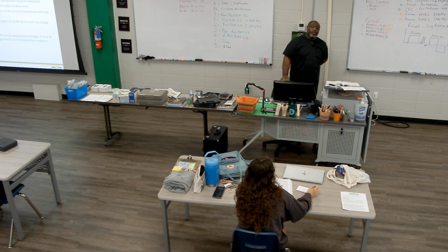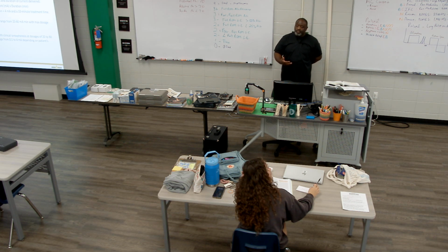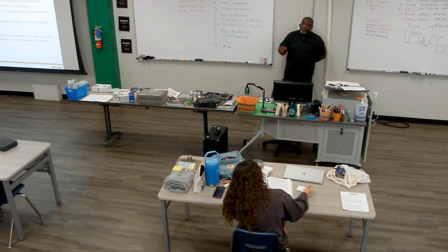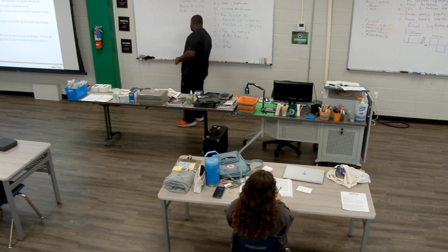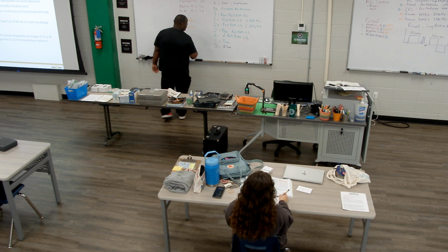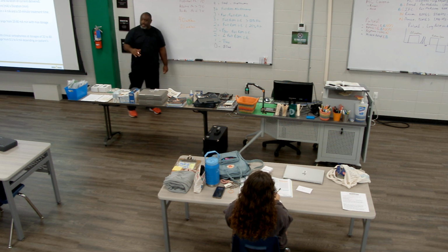That's not preset by the device; it's usually communicated to you by the physical therapist. They may say, I want 40 milliamp minutes, or I want 80 milliamp minutes. Those are the two most common dosages for patients.